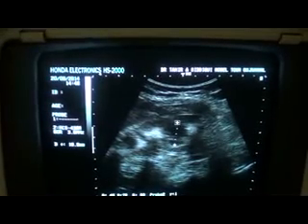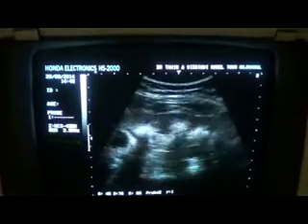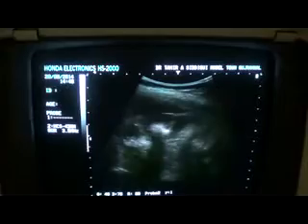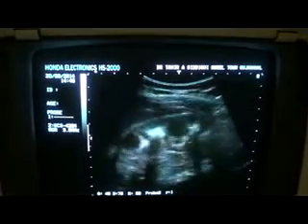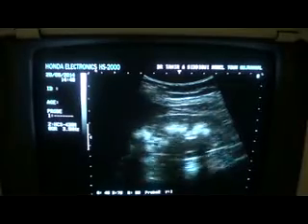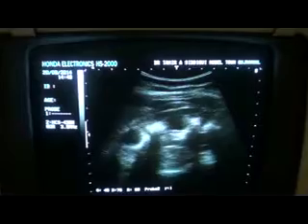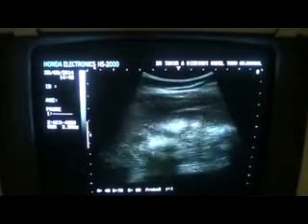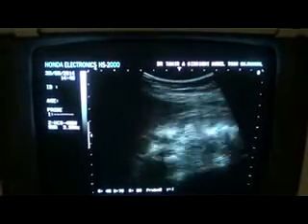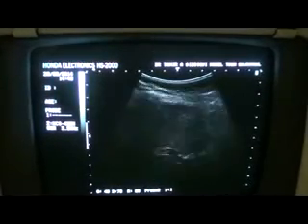This is a cystic area in the anterior mid region of the parenchyma, and it is not unusual to be seen in cases of medullary calcinosis or medullary sponge kidneys. So this is a case of medullary sponge kidneys in a 28 years old young female.